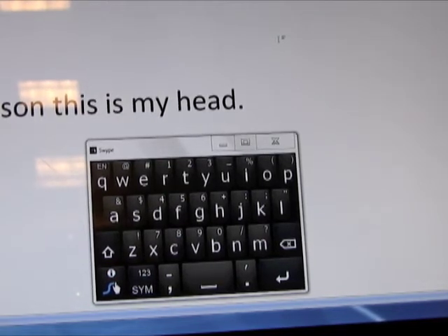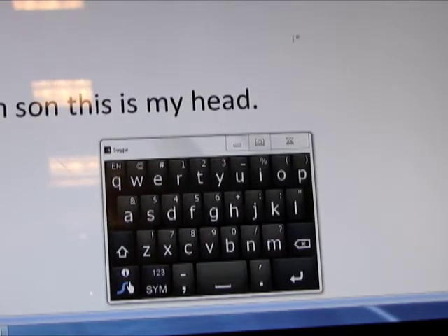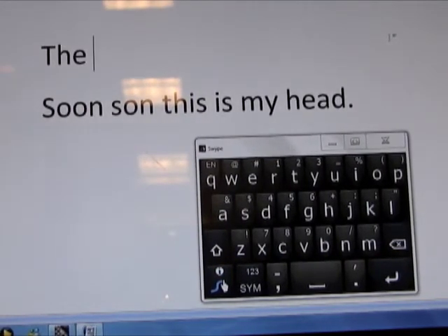Right. So for the first time, really, people with disabilities who can't use their hands can now control a mouse and enter text at about the same speed that someone who's non-disabled using their hands could do. And it'll be available, it's available now? This is not yet available, so probably toward the end of this calendar year.